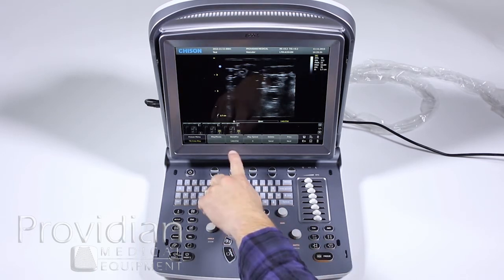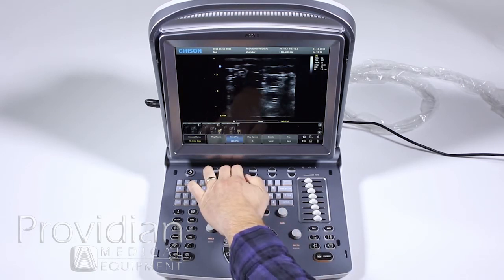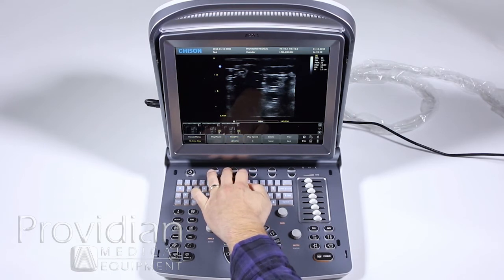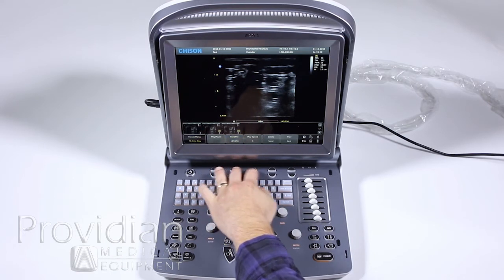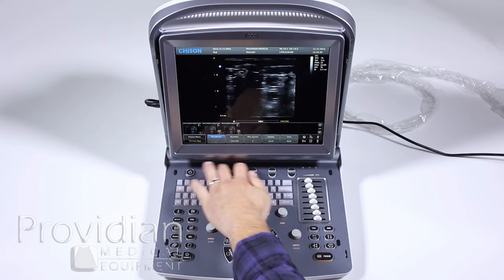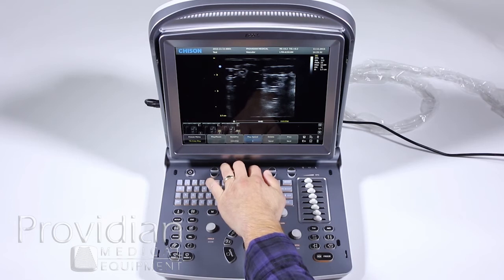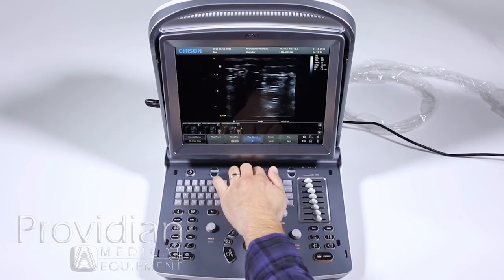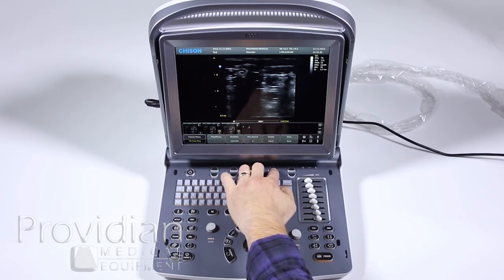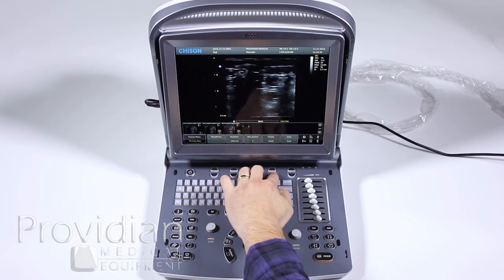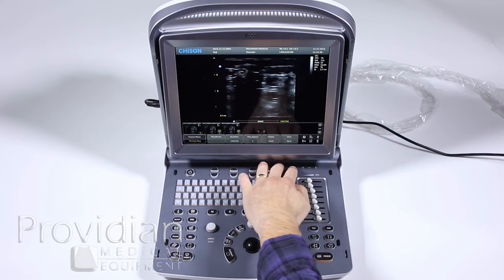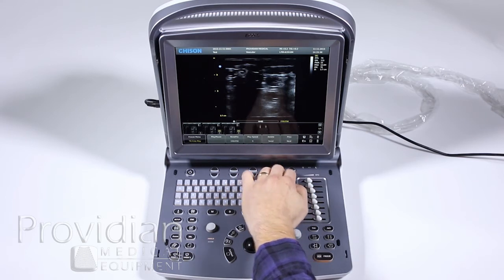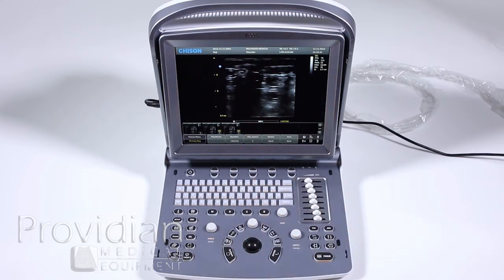There are also menus to help you scroll through the cine loop. You can change the play speed higher or lower while playing. You can delete clips, send to DICOM, and use previous or next to navigate between clips. Let's go ahead and unfreeze.